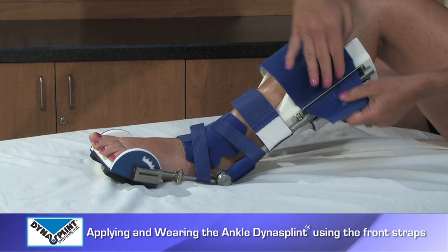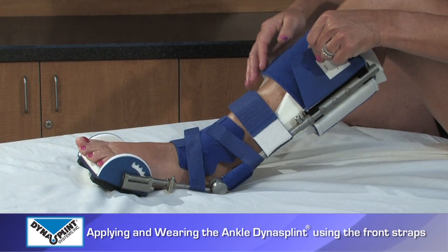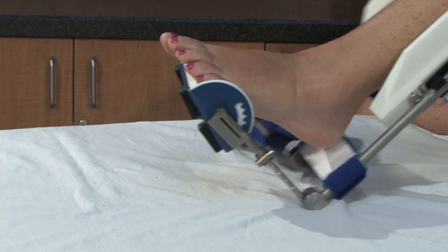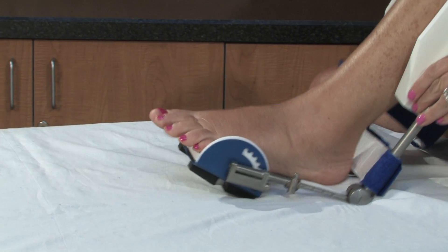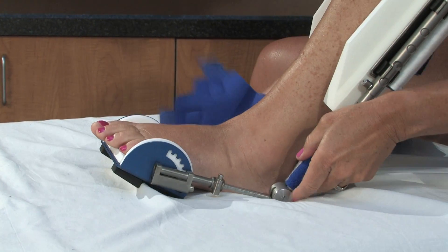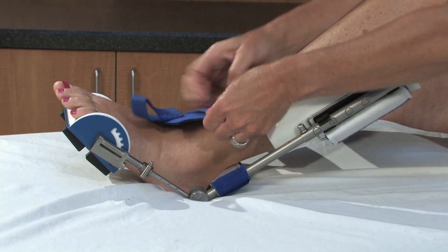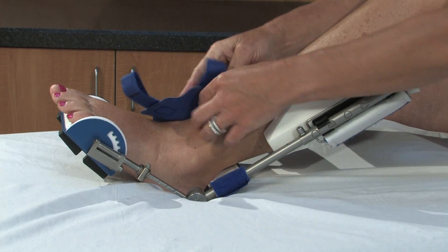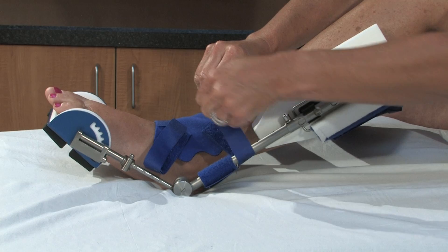In order to apply your ankle DynaSplint using the front straps, completely open all straps and slide your foot into the DynaSplint. Push the footplate until the two round cams are even with your ankle bones. You can hold this in place using the butterfly cuff.